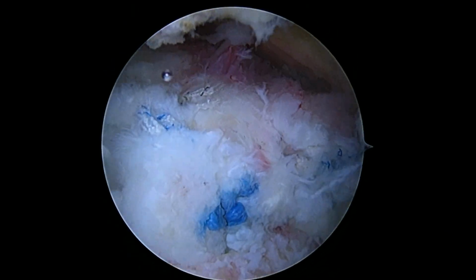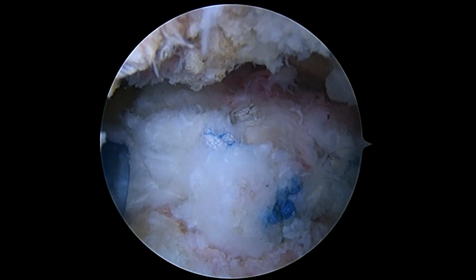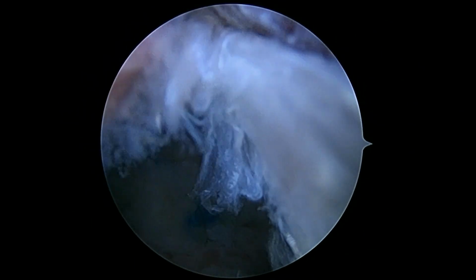And as you look at your shoulder now, you can see that's all repaired back to the bone. As I rotate, everything's moving together as a unit. We're going to take a punch and make some little holes in the bone here, just so we can open up the marrow space a little bit.